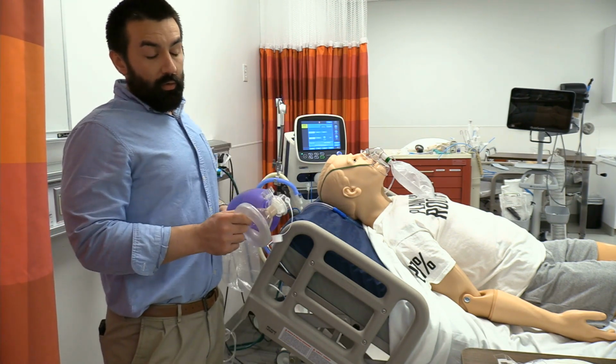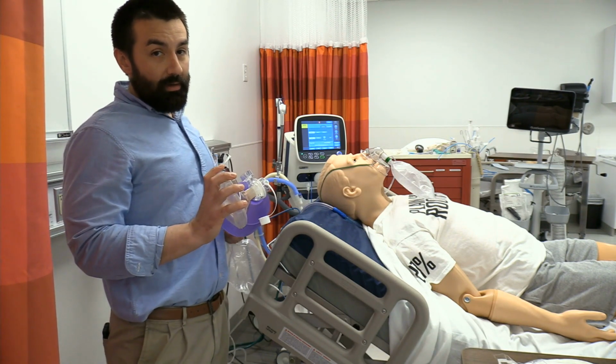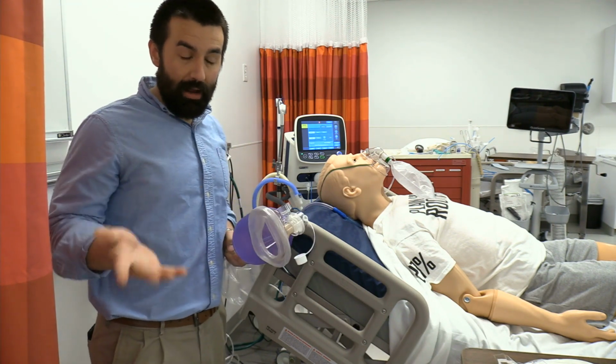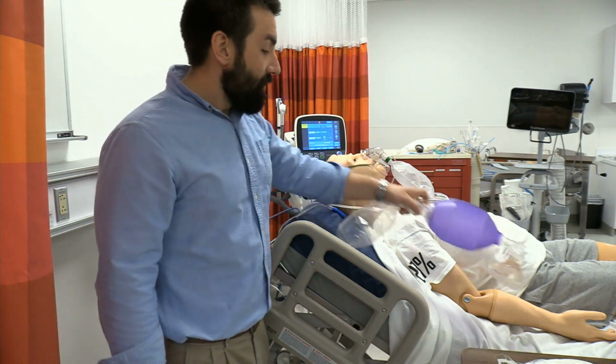Even though we're hopeful that we're not going to have to utilize this mask, we need to make sure you have it, all right? If whoever's intubating is unsuccessful at placing that airway, these patients are going to have drugs on board and not be ventilating. We have no choice but to provide manual resuscitation. So I got that up and rolling.